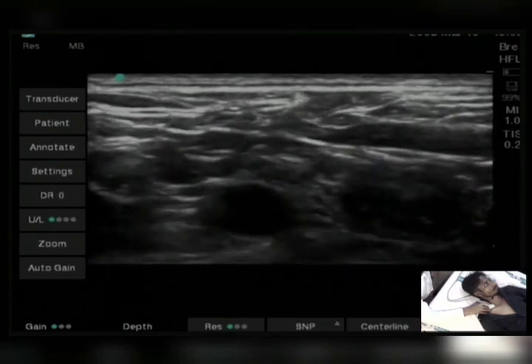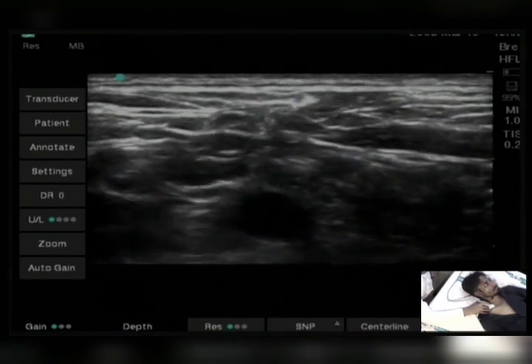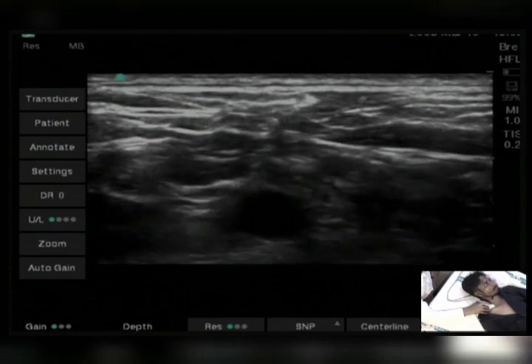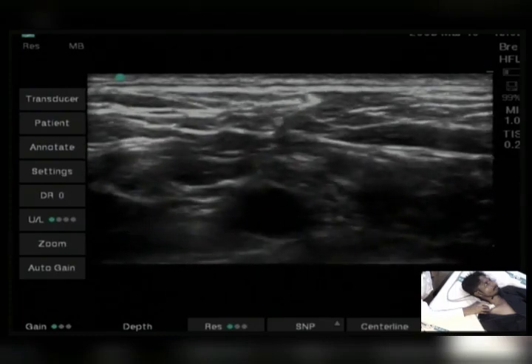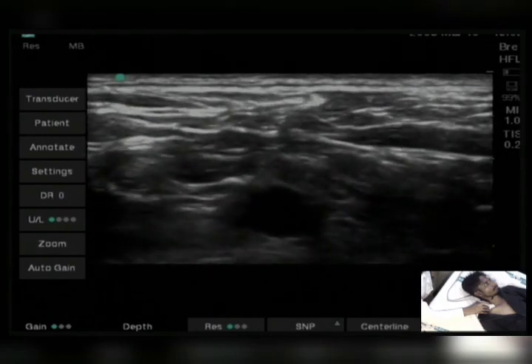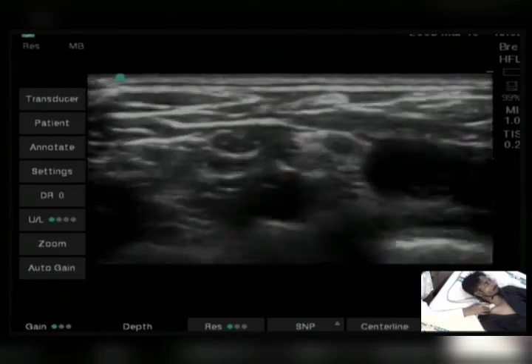Can you see some pulsation in the superficial transverse? So that is the superficial cervical artery, which is in between this brachial plexus and this cervical plexus, about to the deep fascia. So you have to take care of these things while doing interscalene block.